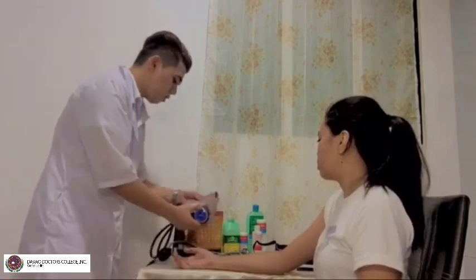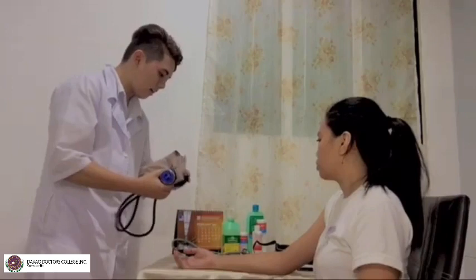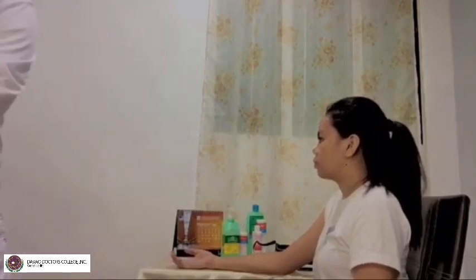Please keep it up. And okay, after wiping the cuff with an approved disinfectant, I'm just going to sanitize this one, and just give me a minute, ma'am. Okay, so after all of this, we need to document and report pertinent assessment data according to the agency policy.